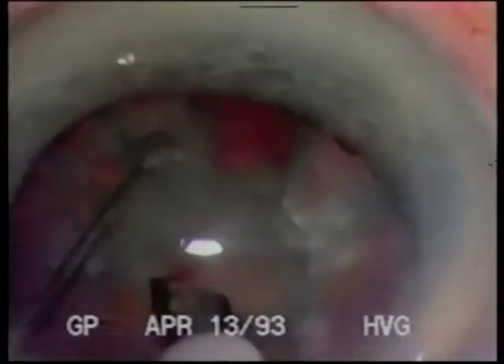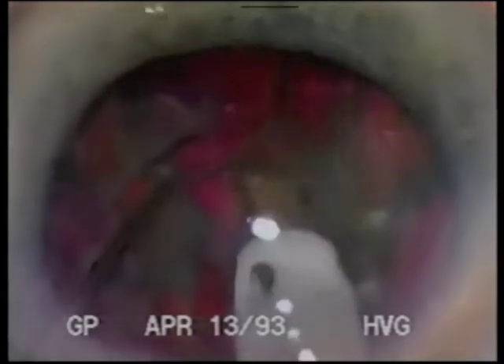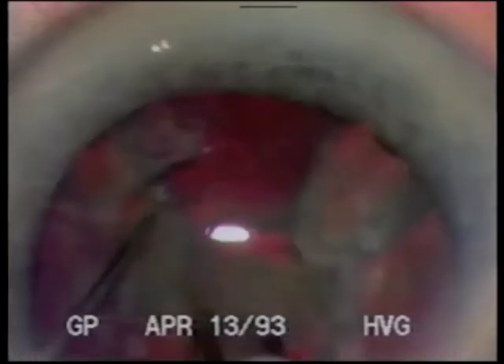Notice that the segments have been broken off without any pre-grooving. In this density of lens, and even in more dense lenses, pre-grooving for subsequent fracturing is unnecessary when one has sculpted deep into the central part of the nucleus for the initial fracture. This is the principle of down-slope sculpting: the lens must be nudged inferiorly while sculpting in the upper portion of the lens, down the slope of the concave posterior capsule.